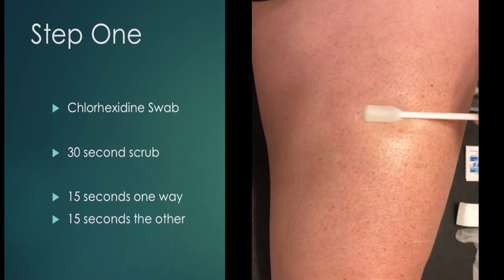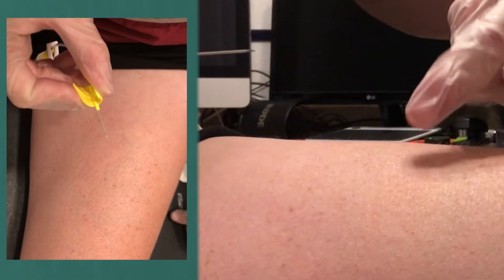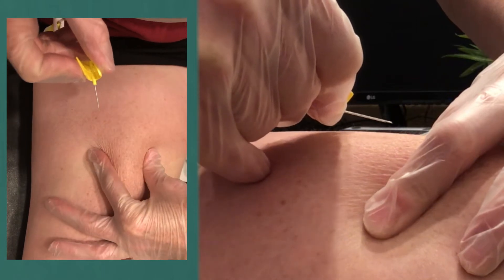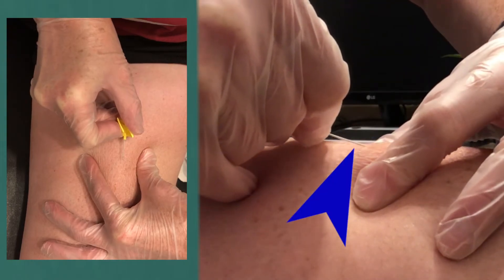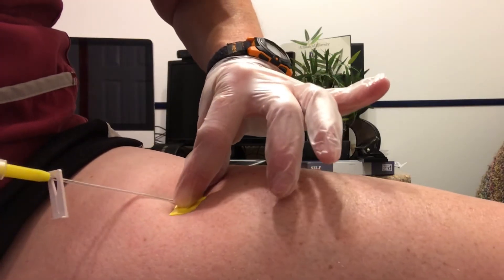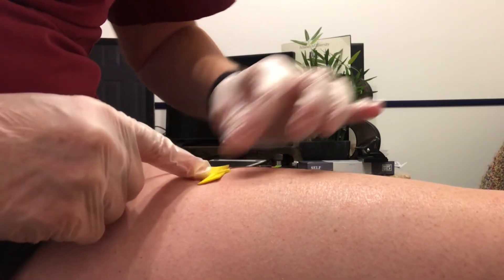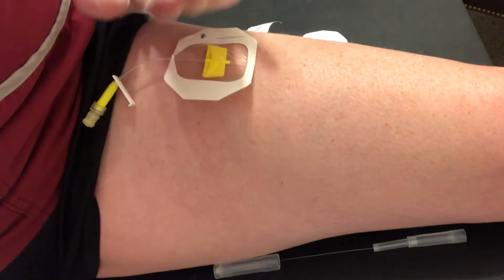Next, we're going to get our gloves on, grab our HDC, take the catheter off, and pinch our skin gently. You don't want to grab too deep because you'll get muscle. Hold the HDC so you're holding onto the bubbled edge with the catheter tip up. Quick insertion into the subcutaneous tissue and we're going to secure that. Grasp the plastic end and simply pull out the needle from your HDC — you're left with your catheter in situ. Now grab your dressing and secure the HDC so we do not lose the line we've just inserted.